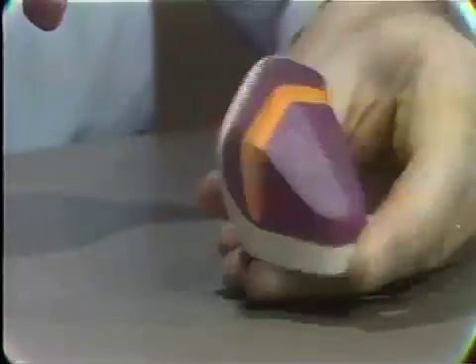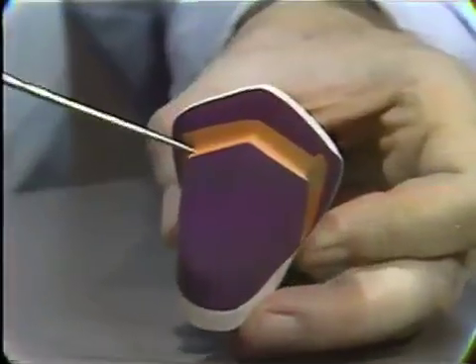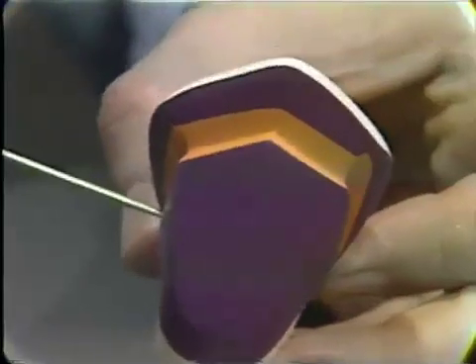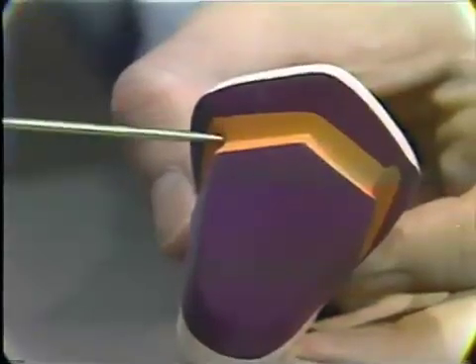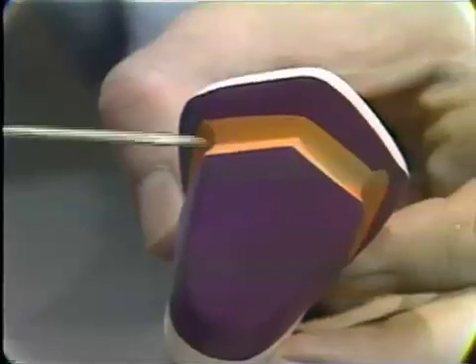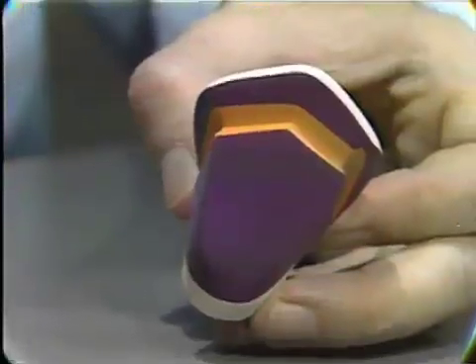The three-quarter crown on the anterior tooth has the same retention characteristics as on the posterior teeth. It has these proximal grooves on either side, and it's on the length of these, of course, and the degree of taper that the retention is secured in this particular type of retainer. There is a groove which joins these across the occlusal here, and that gives some retention to the preparation. It also gives adequate strength to it, of course, as it runs across from proximal to proximal.